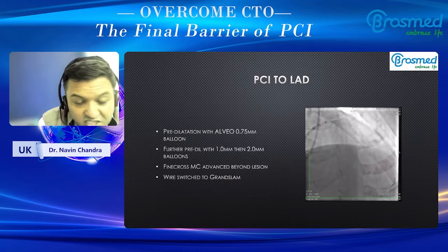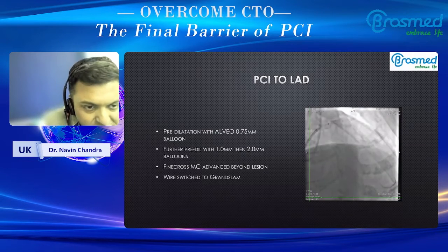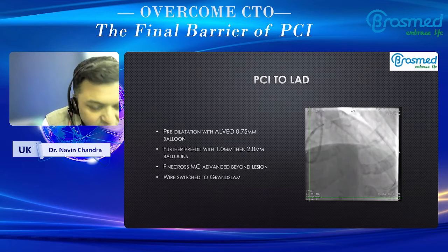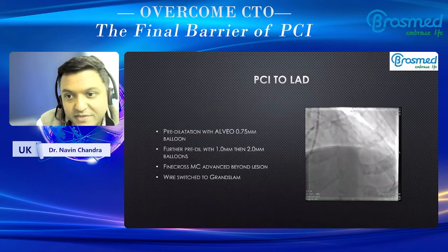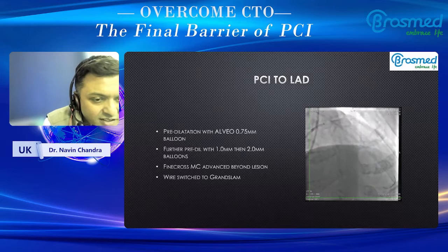This was actually, I must say, quite easy to deliver, but you can see from the video a little bit of bowing in the proximal LAD from that initial push and wedging the balloon into place prior to our first predilatation with that balloon. Once the first predilatation balloon occurred, it allowed a little bit of give, and the balloon could then be delivered further into the distal segment of this mid-vessel lesion.